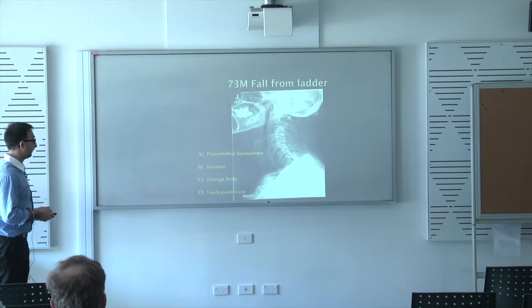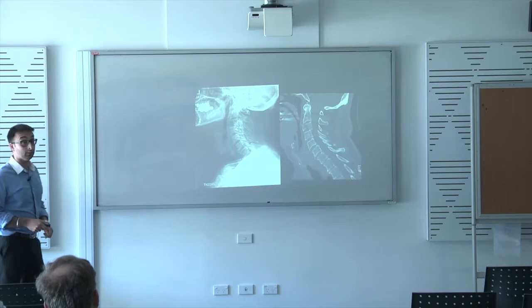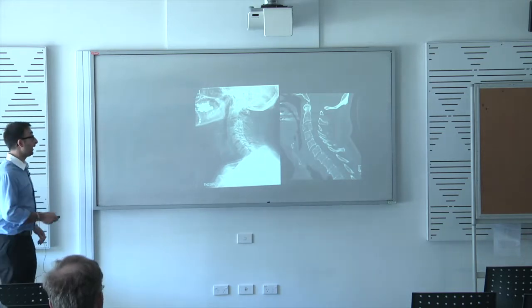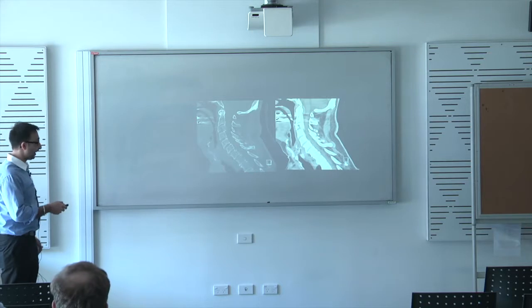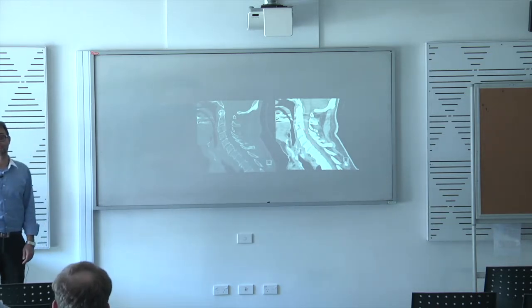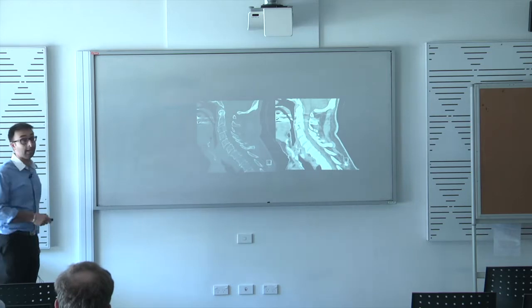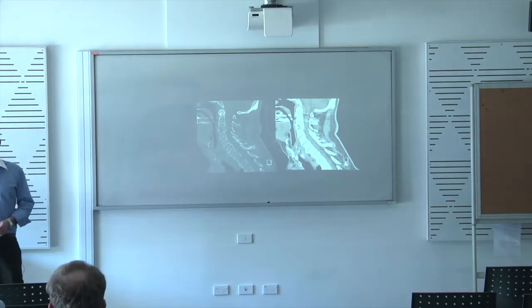So this person went on to have a CT scan, and what it shows is that they do have a fracture of C2. There's retropulsion into the spinal canal here, as you can see. And these are the soft tissue windows. So you can imagine, say you get a bit of the cerebellum, this is the spinal cord in the spinal canal here, and it's causing mild vertebral canal stenosis on the CT, but you can't, as you know, fully evaluate the spinal cord on CT, and if there's any neurology, they should really get an MR.